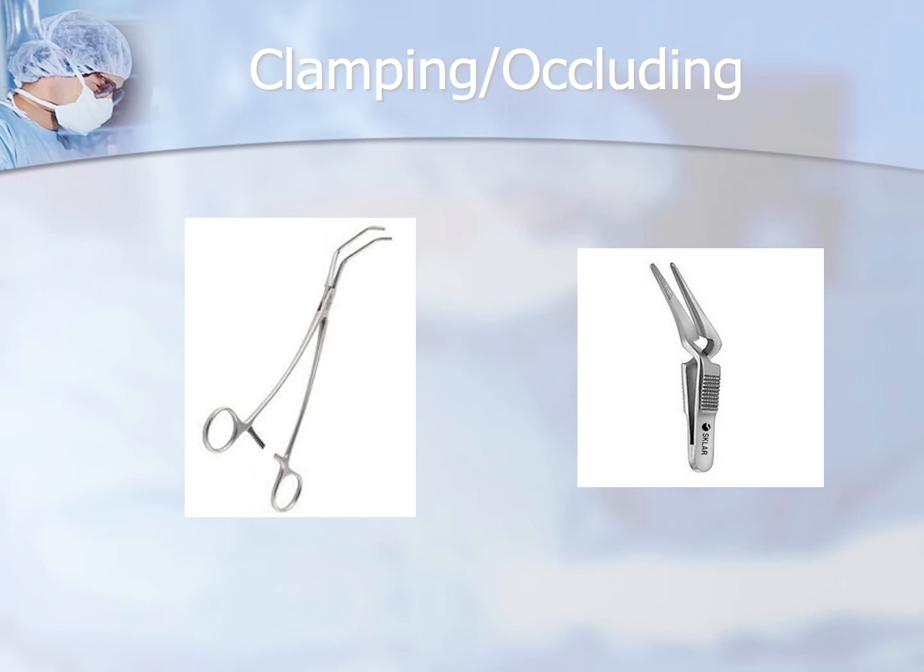The one on the left is called a Satinsky clamp. That might have also been in the How It's Made video. I'm not 100% sure. But this is used for clamping large vessels. And then on the right side is called a bulldog clamp. And this is used in vascular surgery to clamp very small vessels.